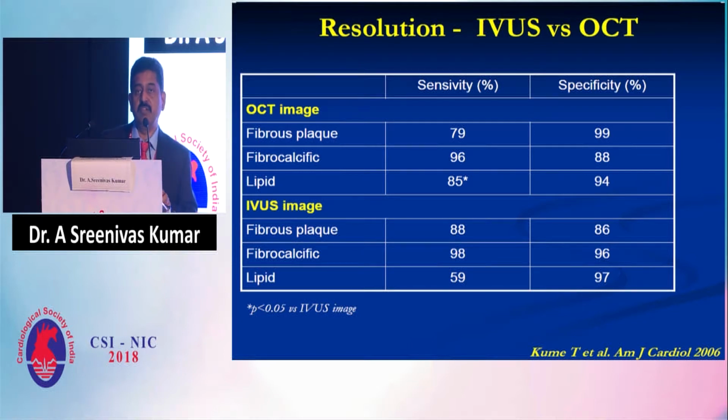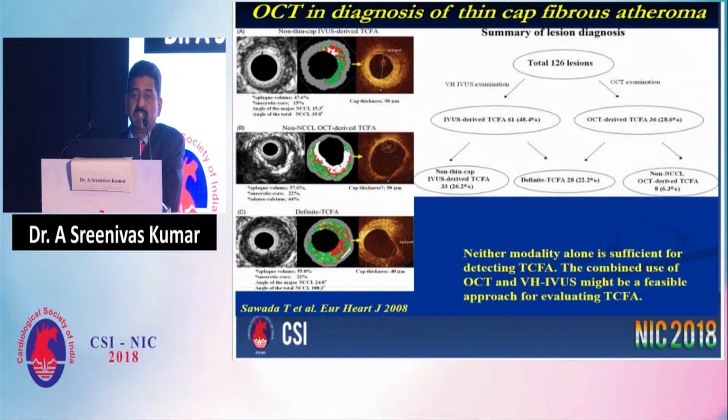What we need to understand is that OCT sees from endothelium to endothelium. That's how the sizes we get are slightly less compared to IVUS. If you understand this, then you're okay, whatever modality you're using. And the additional things we learned about the pathogenesis of these various plaques, that's where OCT scores particularly, to decide what sort of therapy we're offering.